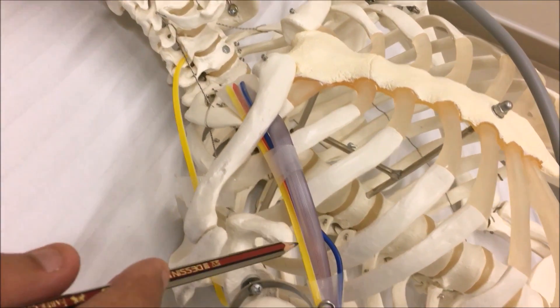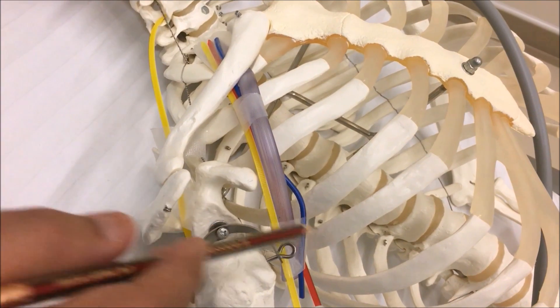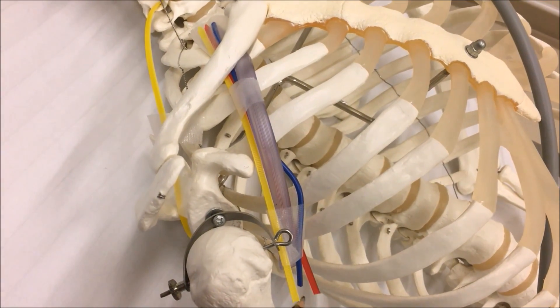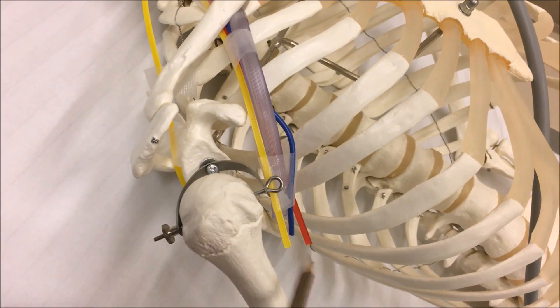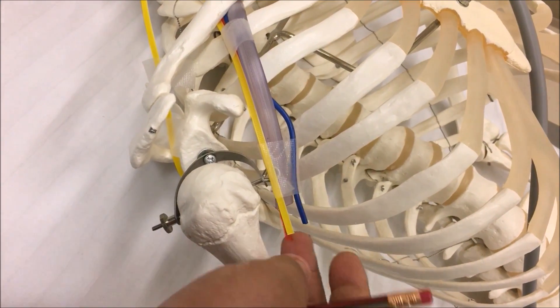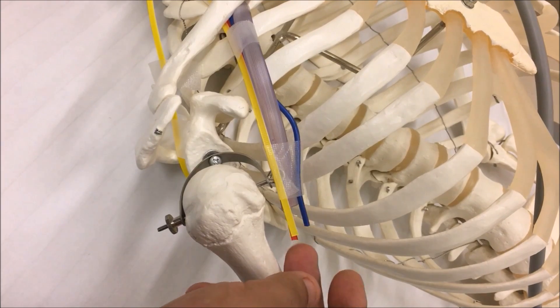Down at the level of the pectoralis minor, the three cords are arranged according to their names: the lateral cord lateral to the artery, the medial cord — the blue one — is medial to the artery, and the posterior cord is posterior to the artery.